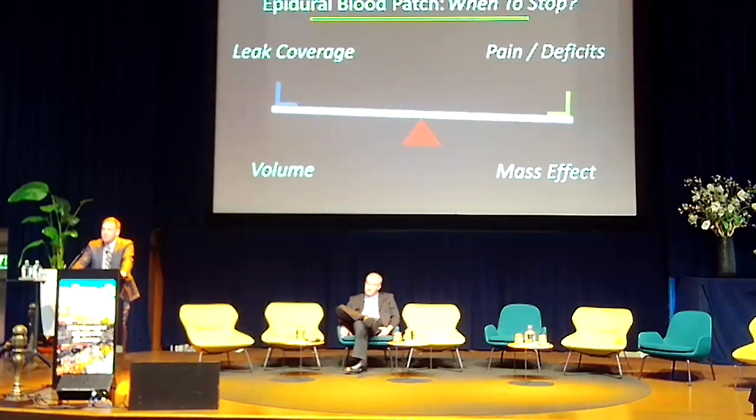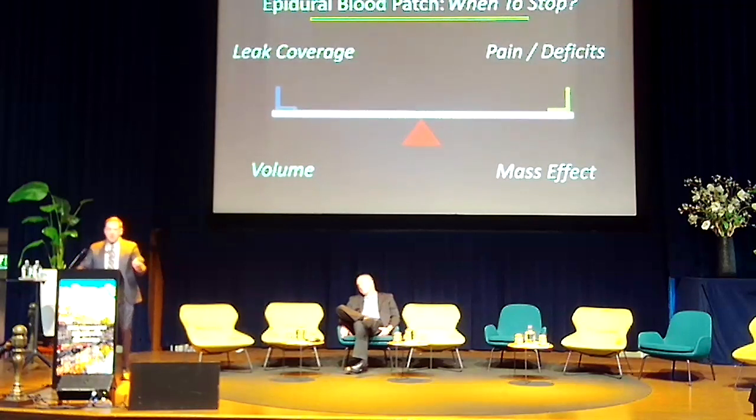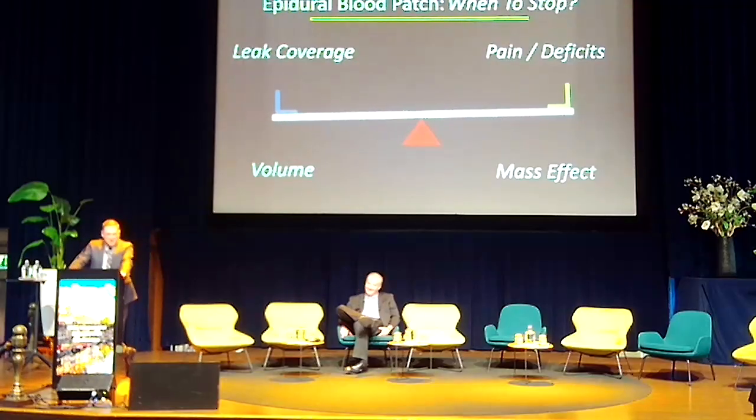The other thing that people do, of course, is they will stop when the patient's uncomfortable. And actually, that's the way I was taught it. Oh, just keep going until the person tells you to stop, right? Which is a very interesting thing to be taught. But that's kind of the standard.